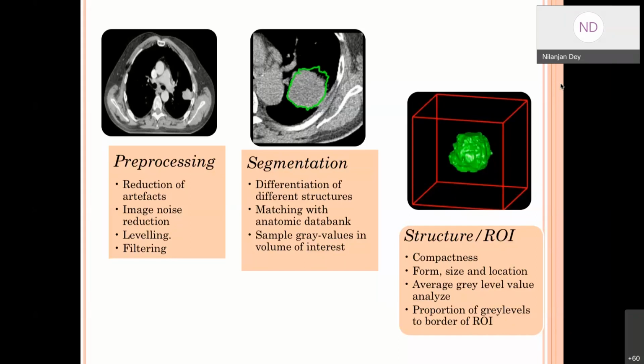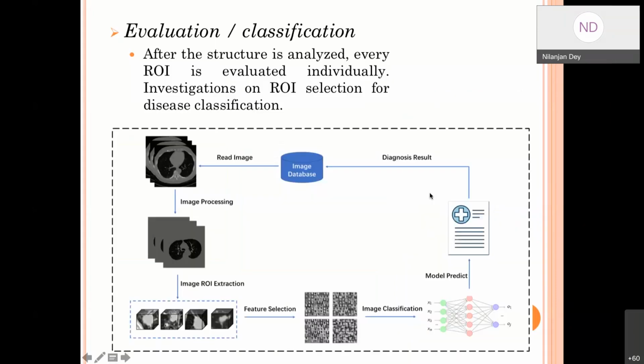So this was actually long back, say 10 years back, in 2010, around 11, 12. That time, it was completely on a shallow learning framework. We used to do all these things in this way. But it does not mean that till date we are doing only deep learning stuff. This also works. Yes, there are some basic changes. But on average, this was the shallow machine learning framework where we changed the different pre-processing techniques, we changed the selection mechanism, we changed the classifier, and we got different results, and we were happy with the results.